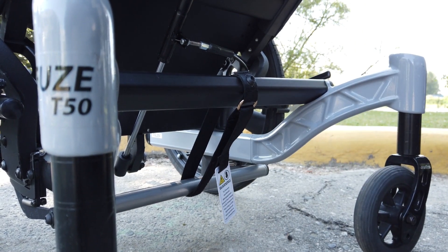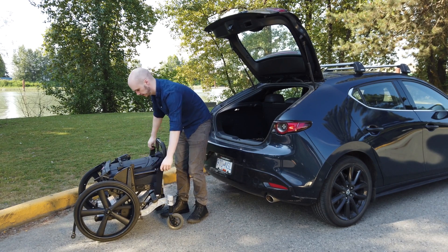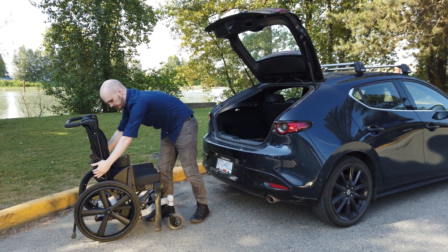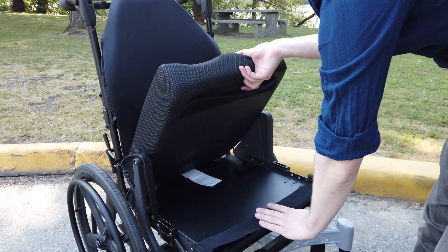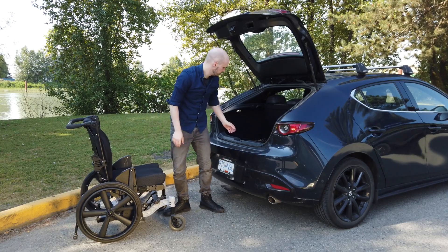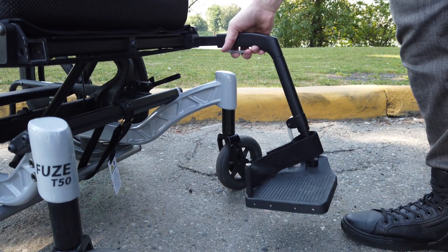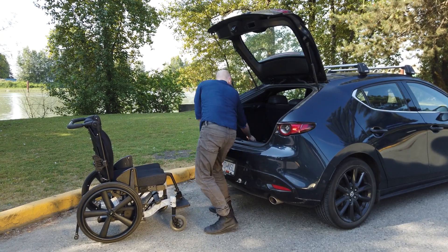Pull and secure the secondary locking strap. Tilt the upper frame back to horizontal. Undo the strap securing the backrest in the folded position and unfold the backrest. Stow the strap ends under the seat cushion. Install the remaining components including the front rigging and armrests.